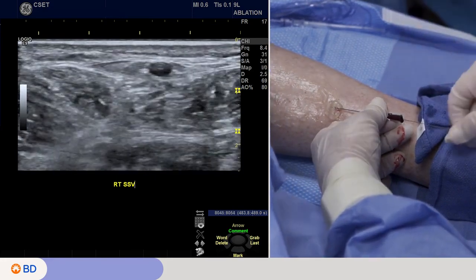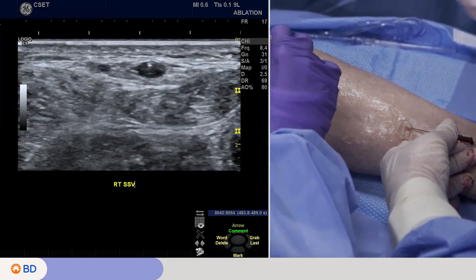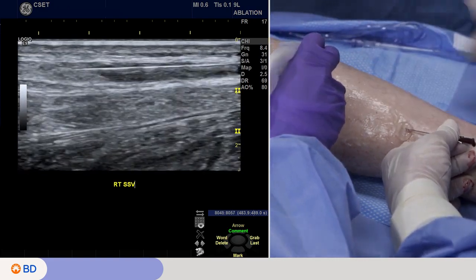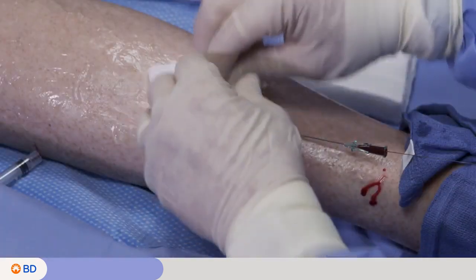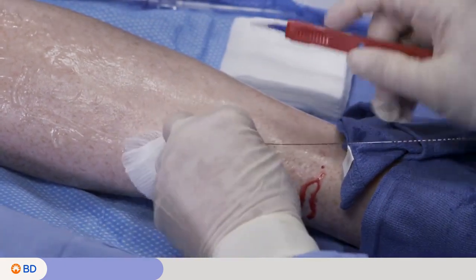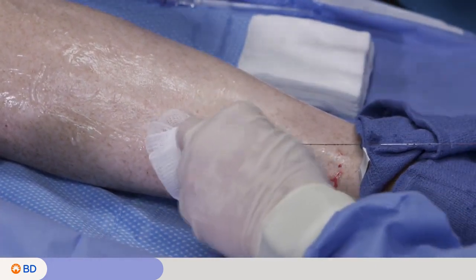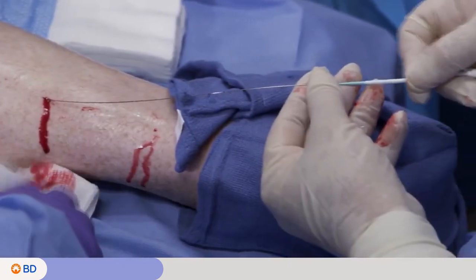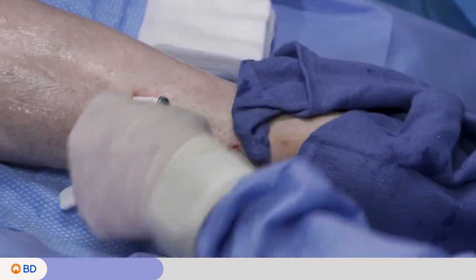And Casey is scanning up, following me as I go. We like to do that routinely to watch where the wire goes, because often it may divert off path into a side branch. Okay, so then we take the introducer needle out. I like to make a small little incision for cosmesis so it can heal very well. You don't have to. And then we thread the micro introducer sheath over the wire and into the vein.